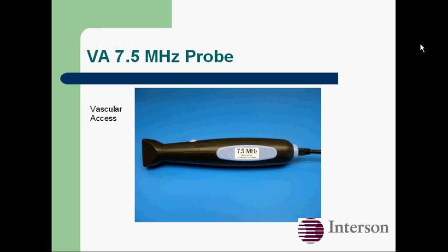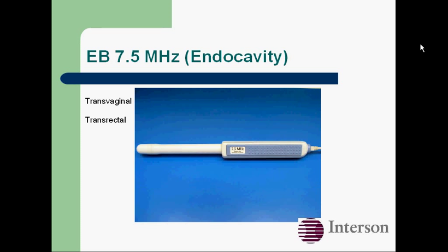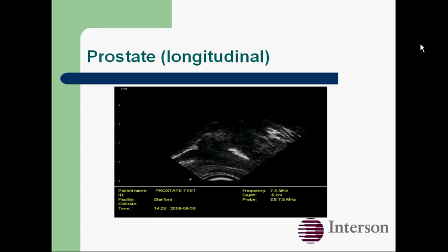Here's our vascular access probe, which is optimized for line placement. Here's a jugular and carotid. This is our endocavity probe, and you can do transvaginal or transrectal scanning with it. Here's an ovary and ovarian artery, and a prostate.